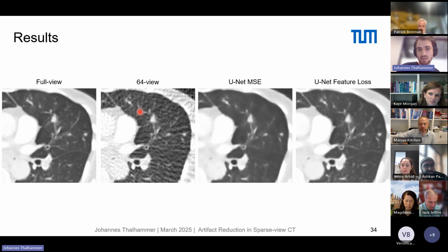But on the other hand, the images are for disease detection, in this case pulmonary embolism detection. And what we tried to show is, okay, if these images are still better in detecting these diseases, it kind of justifies the cost, so to speak. But of course, that is something which absolutely must be considered.